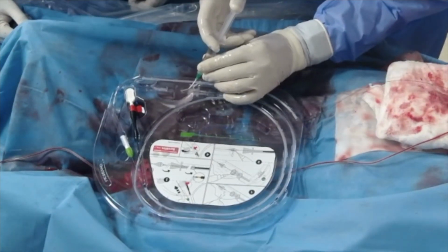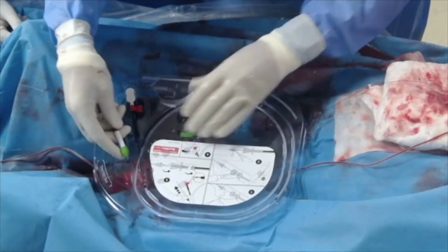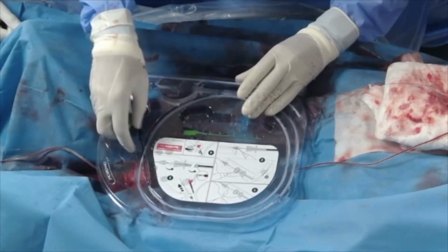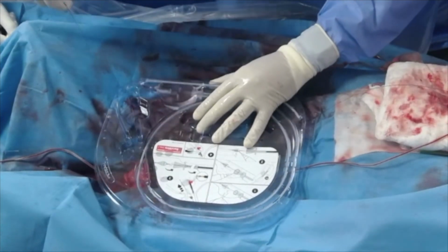Unfortunately, I didn't have a Cello guide at that time. I wasn't using a balloon tip guide, so no proximal protection. I didn't have a Spider FX Medtronic filter which I could have taken on my Traxxas wire, which was 100% sure into the true lumen. I had to use a NAV6.